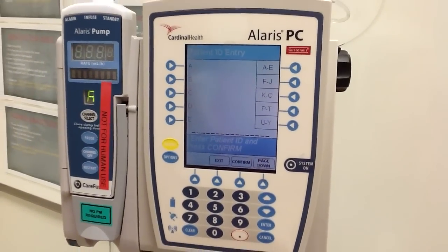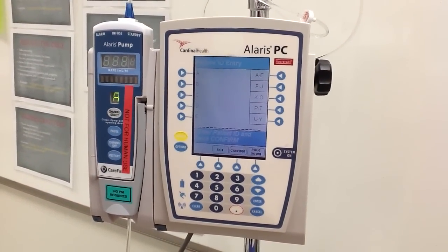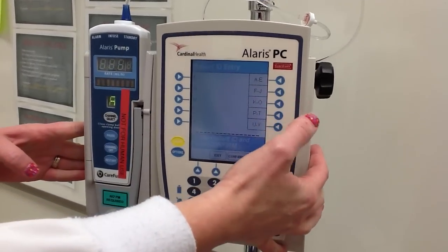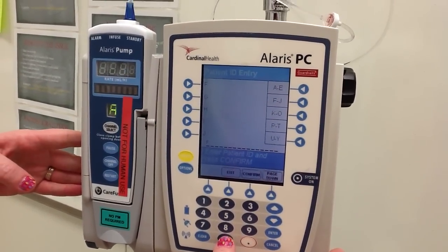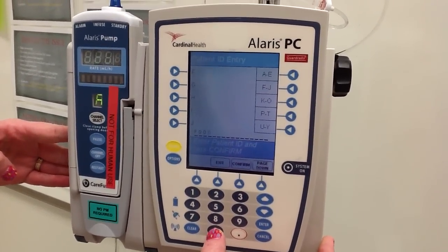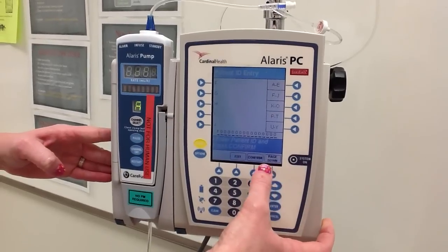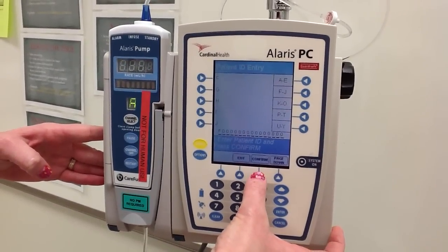It's then going to ask you for your patient ID. This is going to be on your patient wristband, and it's going to start with the letter F. So we're going to hit the F key, and then follow it with the numbers on the wristband. For demonstration purposes, I'm going to enter zero. Once you've completed your patient ID, you're going to hit confirm.